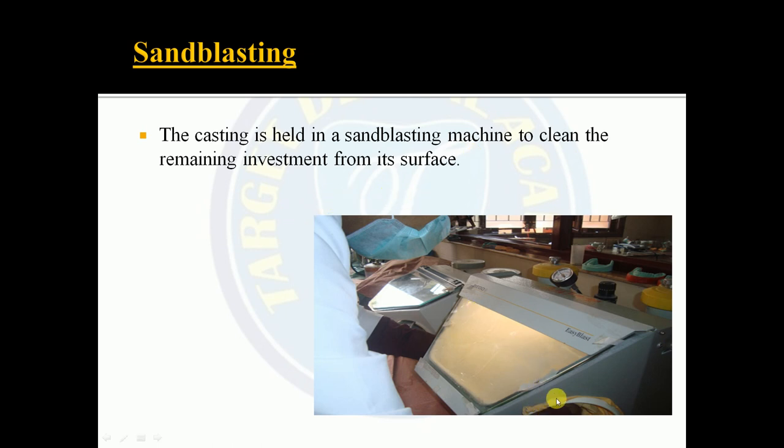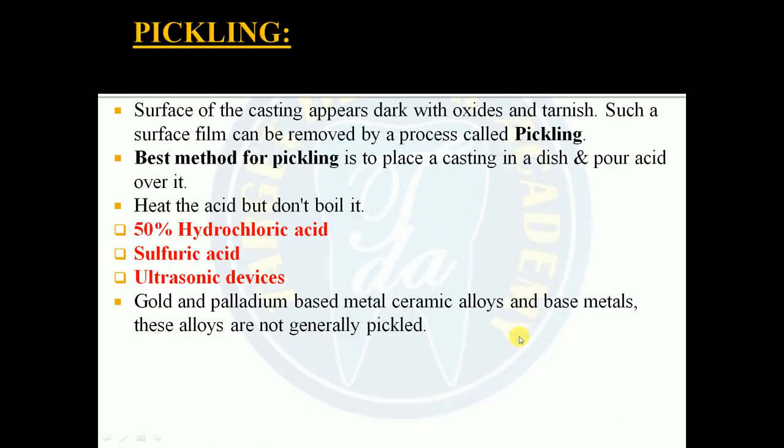This is the sandblasting machine. You have to put your hands inside the sandblaster, and the machine is there to clean the remaining investment from the surface of the casting.